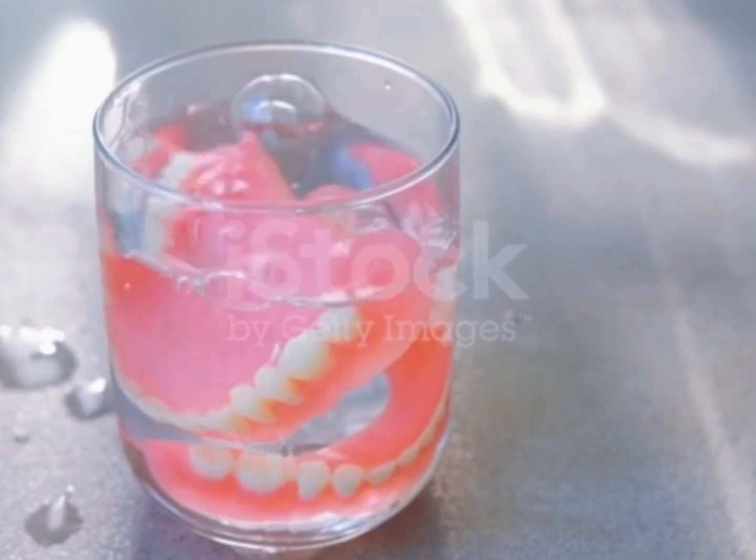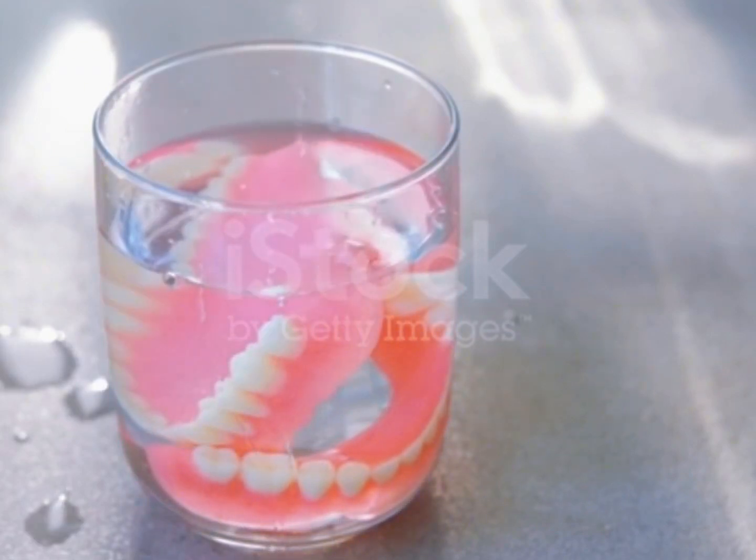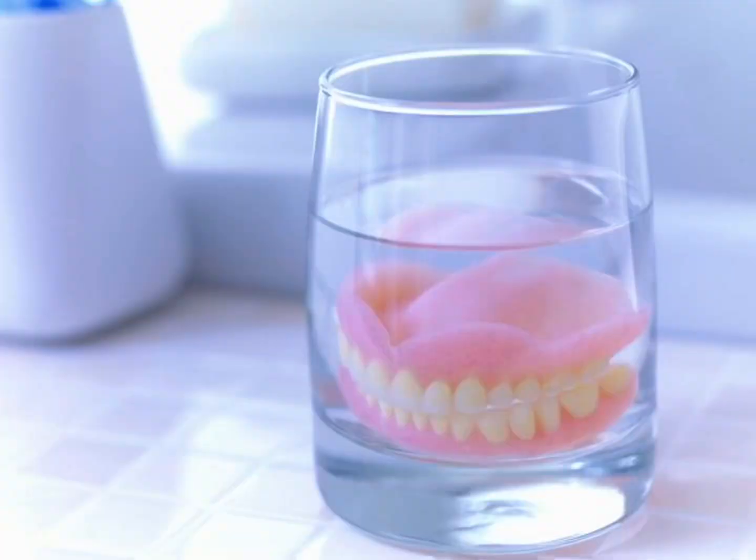Be sure not to use regular toothpaste on your denture, as it can be abrasive and damage the denture materials. Soak your dentures overnight in a denture cleaning solution or water. It is very important that you soak your denture in water. When you want to go to bed at night, remove your denture and put it inside a cup filled with water. This will help your denture to last longer.